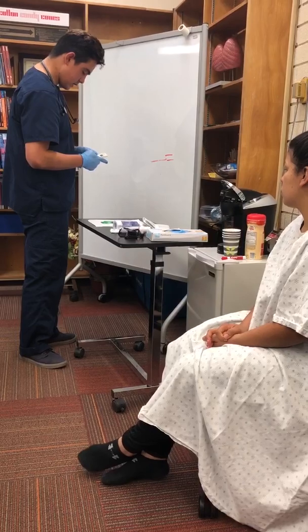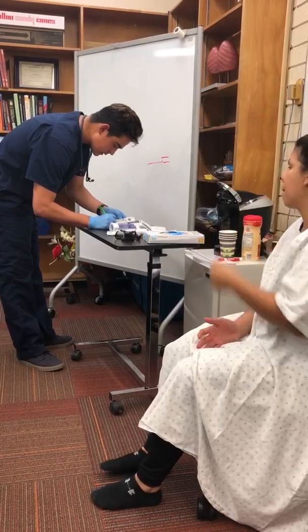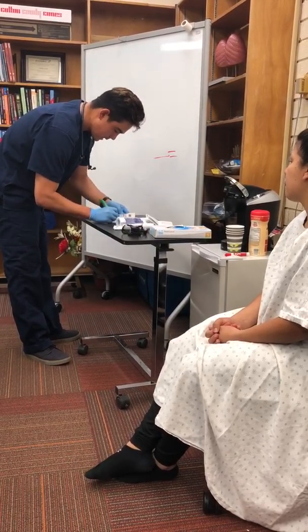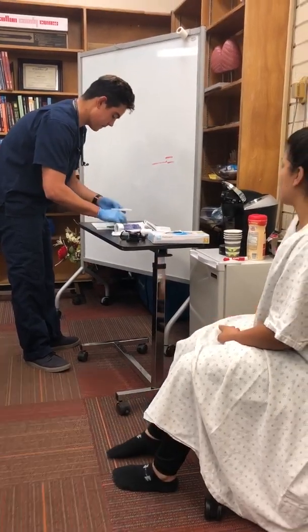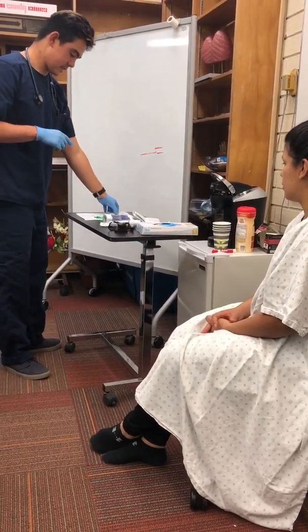So 220 divided by 210 equals 1.04, times 100. So we're at 104% improvement from your first one. So good job. That means the albuterol is working very well. And you said you're feeling better too? Yeah. Okay, and no wheezing on breath sounds.